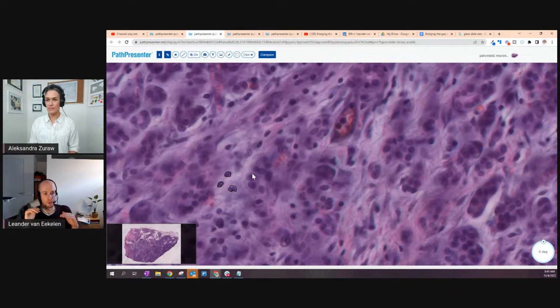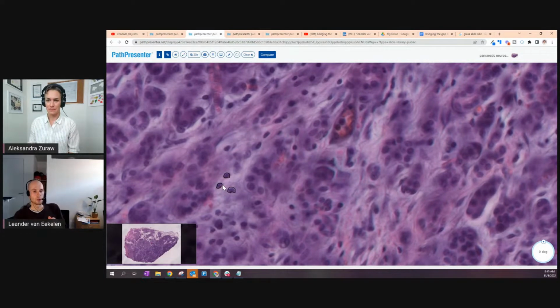Then there's a few different flavors of segmentation that are also important to note. I was just talking about segmentation in general, but there's subtypes. So here's my version of segmentation, and here, see, I didn't segment this one well. But yeah, so basically I wanted to incorporate the whole thing in my annotation. So let's say these are segmented. Exactly. And so then a couple of flavors.